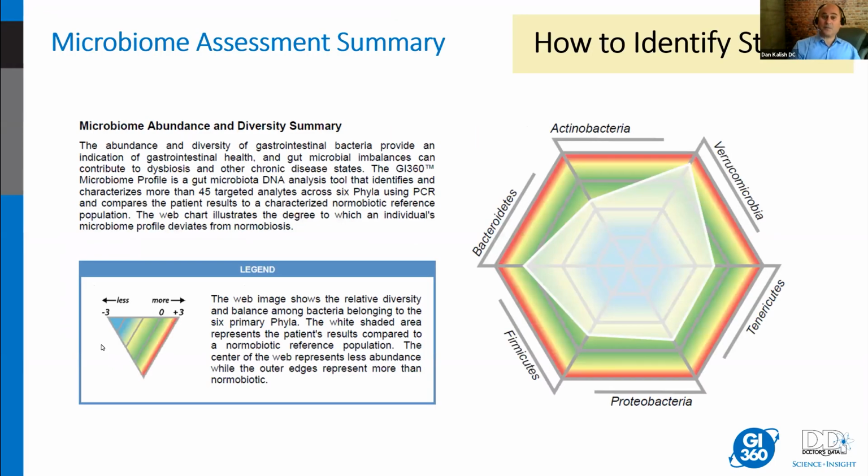The next thing, this is a little more complicated perhaps, but the lab has done their best to simplify this, is you look at the microbiome assessment page or section, okay? And it's honestly a little overwhelming to even name all the different organisms. This is a very complex area of science, and I don't think any of us, even someone like myself who tries to study this stuff day and night, has any kind of grip on the numbers and diversity of these organisms, right?